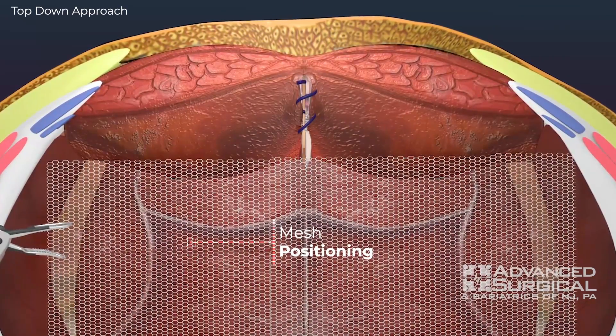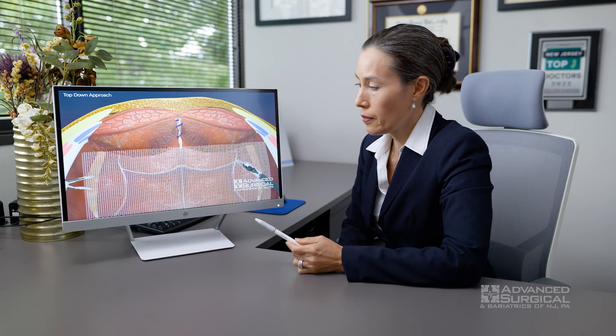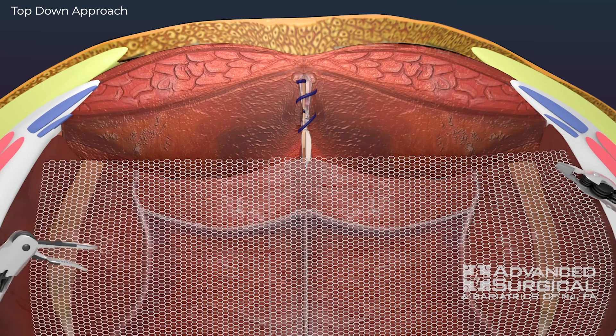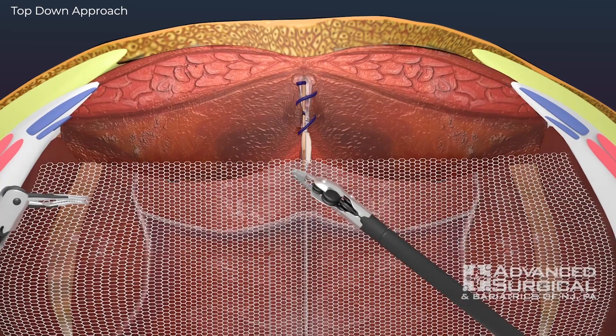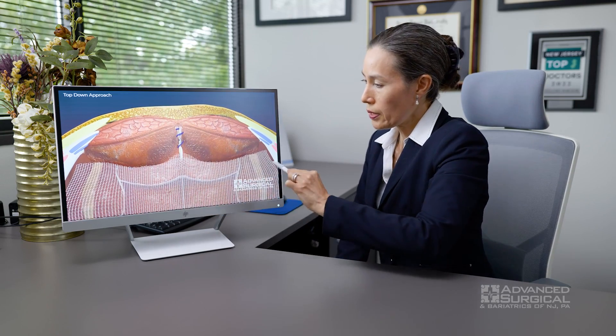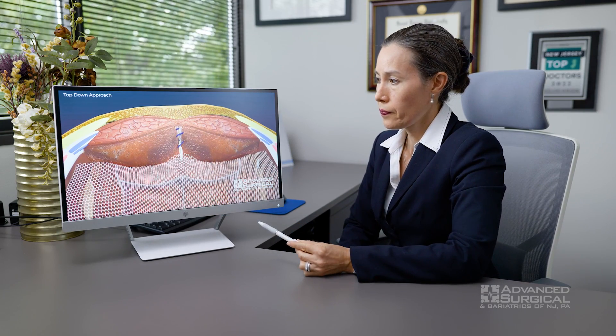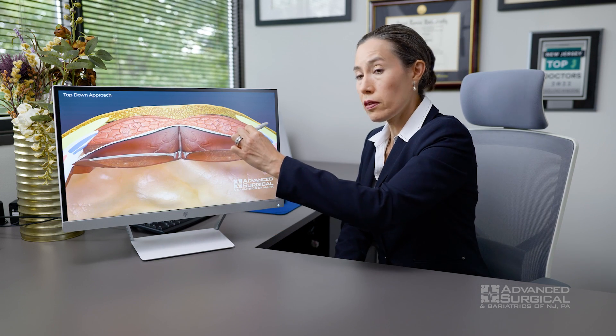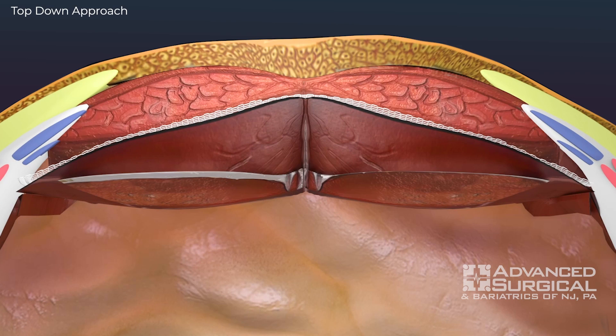Here's our netting material — it's basically just fabric netting. We measure the space exactly to fit it perfectly, then roll it out and lay it flat. To complete the hernia repair, we allow all the layers to collapse, and the abdominal wall itself is going to completely seal together as you heal.